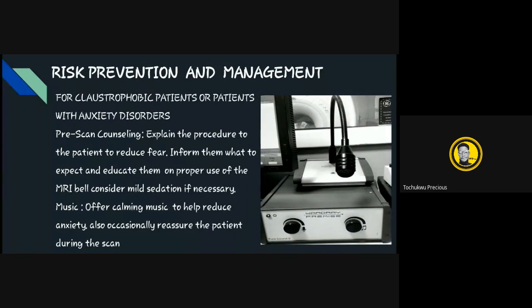This is like a microphone that you can use to interact with the patient. So you should ensure that you maintain a two-way conversation with your patient.